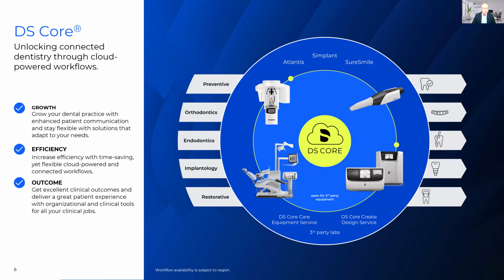You can be flexible with the solutions that you have, and then also being able to adopt all your technologies and bring them together connected through DS Core, making you much more efficient, saving you time, ultimately saving you money, and being more efficient with your patients. And the outcomes, you're going to get much more efficient outcomes and predictable outcomes clinically.